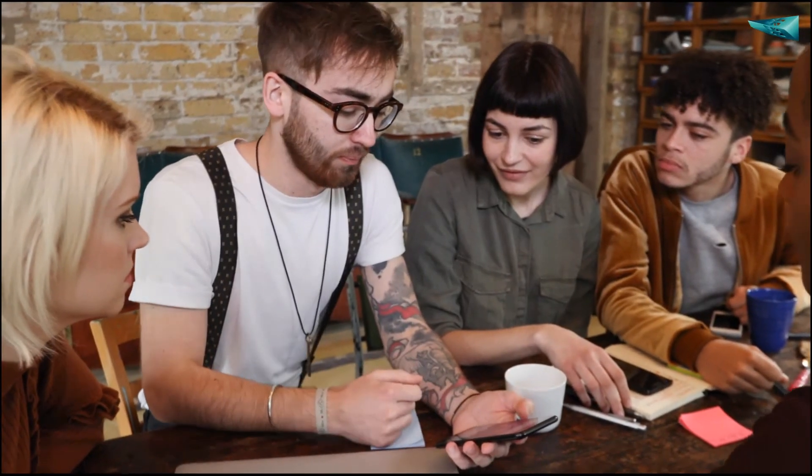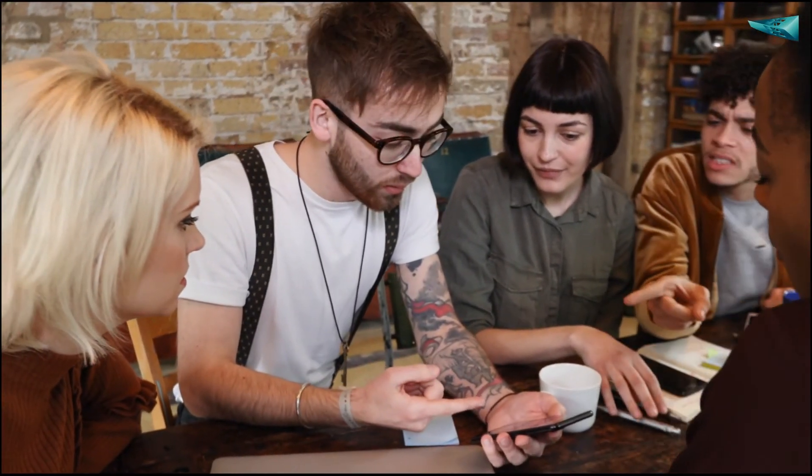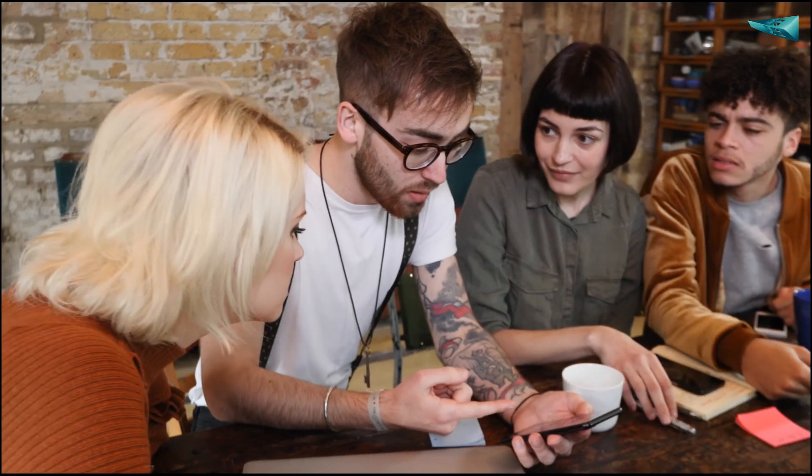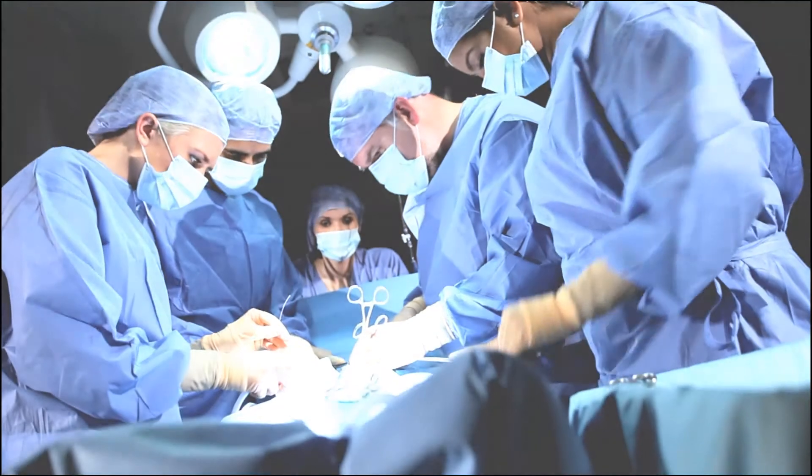In addition, you can benchmark your suture skills with other medical students and doctors around the globe. Pre-order Easy Surgery now and become a doctor ready for the surgical challenges of tomorrow.